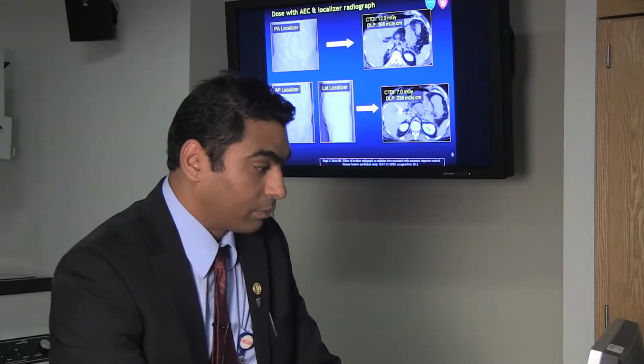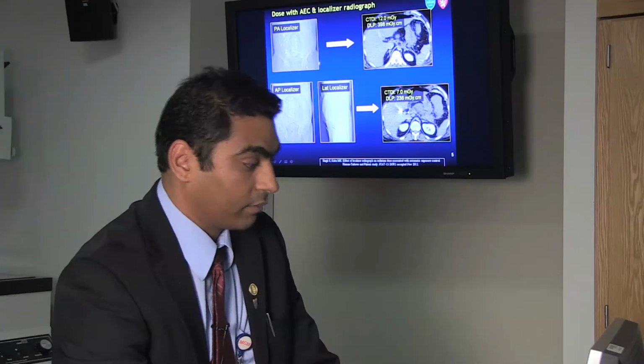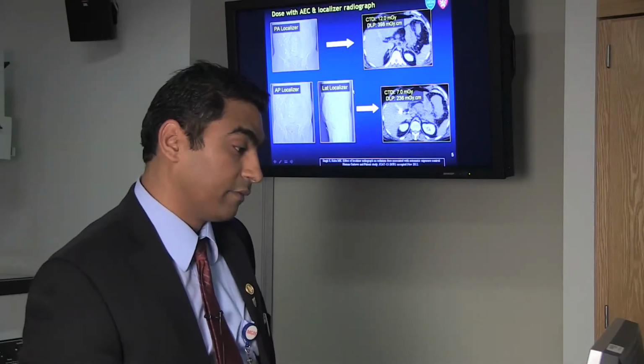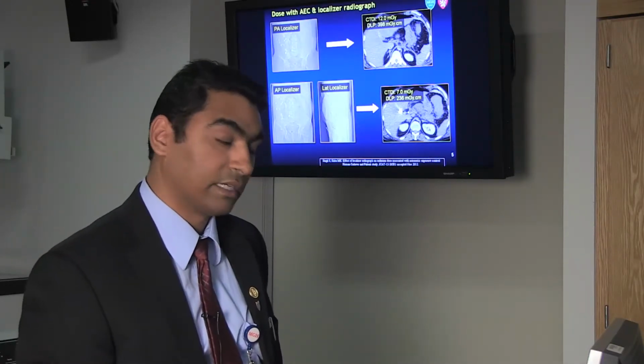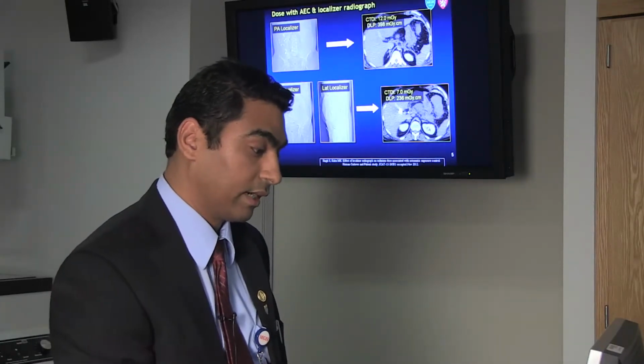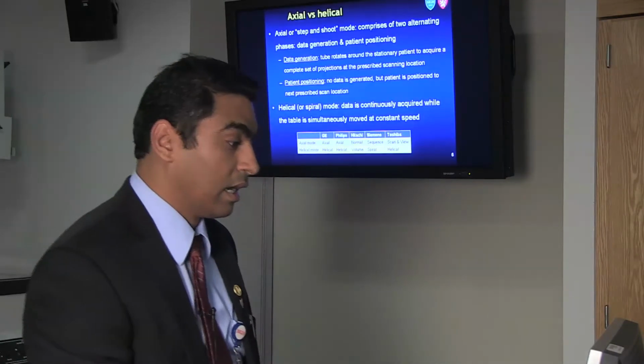Now, here's an example of a PA localizer, and we have an AP localizer and a lateral localizer. Recently we found out it's very important to have the right set of localizers, which could also affect your radiation dose. So it's very important to understand the definitions of localizer.